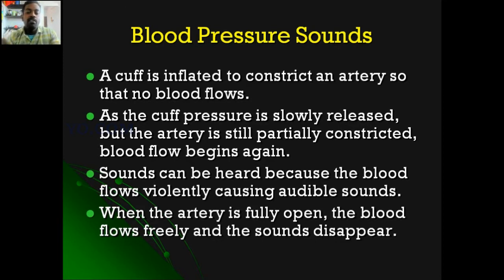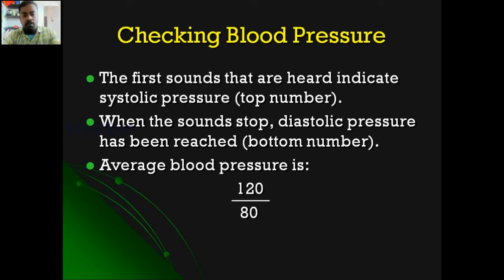When the artery is fully open, the blood flows freely and completely through the artery, and there is no sound. So the sound will disappear. When we are releasing the pressure, at that time the blood flow starts. It is like water flowing through a pipe: if you press the pipe, the pressure increases and it makes some sound. In the same way, blood flowing through the arteries creates some sound. That is the blood pressure sound.